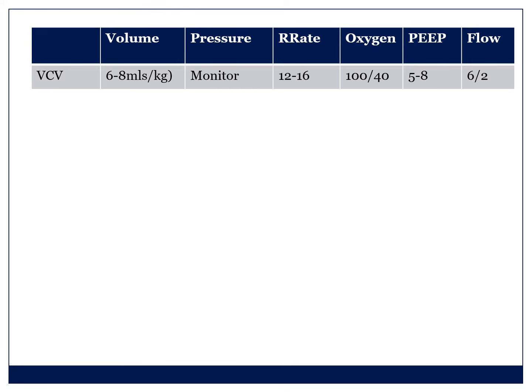And then the flow, the gas flow rates, start at 6 liters per minute for 6 minutes. So you can wash in the volatile anesthetic and go down to 2 liters per minute once you're stable. That's the guidelines for district hospitals. You'll see in tertiary hospitals we go a lot lower than 2 liters per minute to save money. But for beginners, before you've got your diploma, 2 liters per minute is the minimum flow.